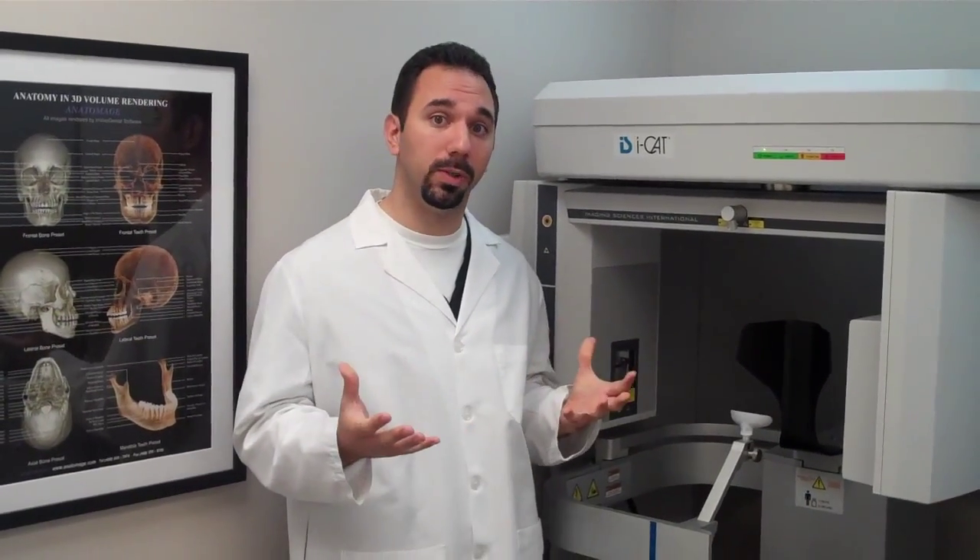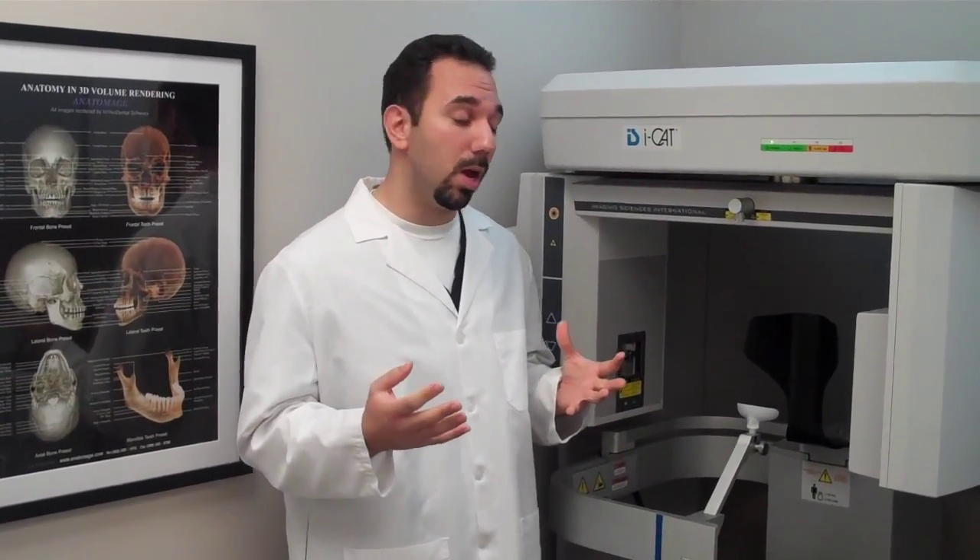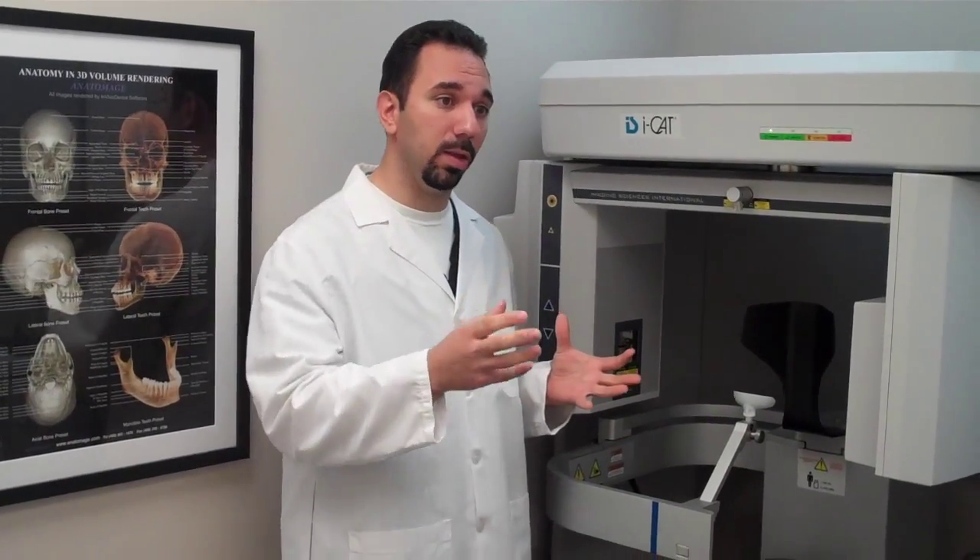The radiation is very similar to the radiation you get with normal dental x-rays, and it also allows us to take the information to a software program and look at everything virtually. So this is a machine that's going to make things predictable, safe, and very efficient.